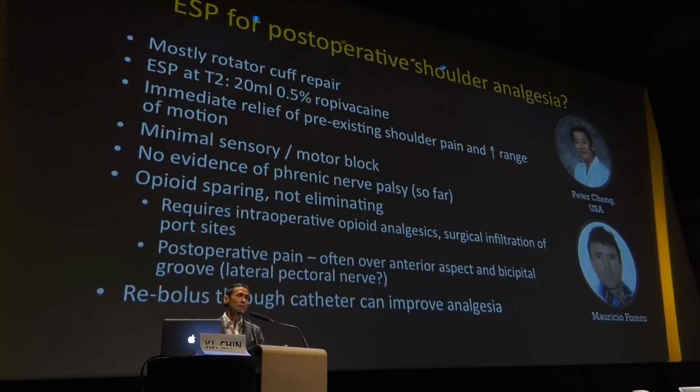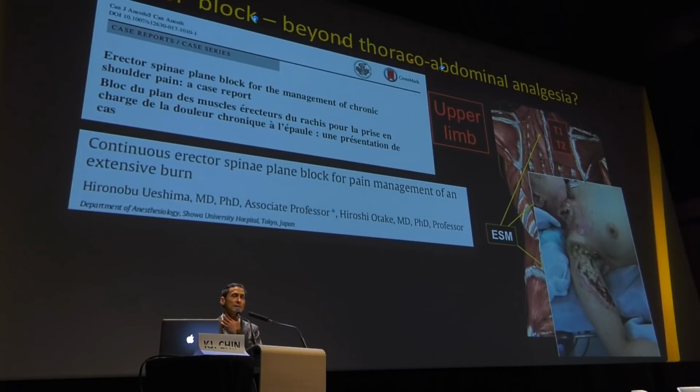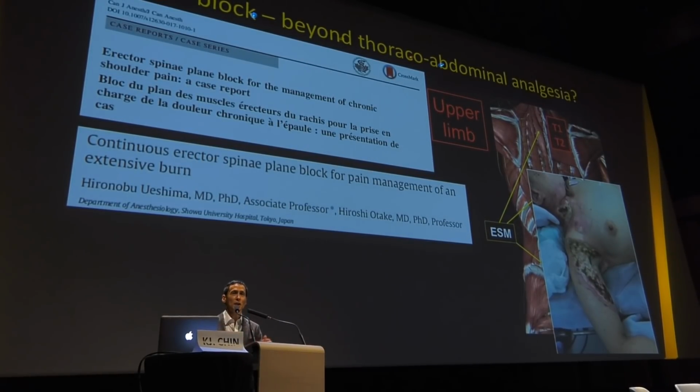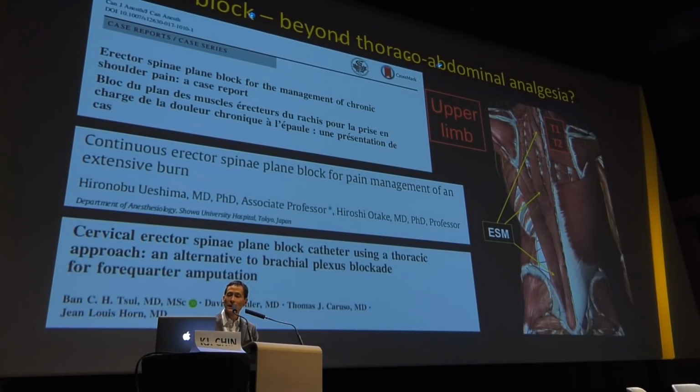But it's an interesting option to think about in patients in whom, for whatever reason, you cannot do a brachial plexus block. And this one report from the Japanese group shows you such a case, a lady who got an extensive burn. You can see that trying to put a catheter into the area of the brachial plexus would be almost impossible. They did an ESP block. The patient had pain relief down to zero. They kept the catheter in for 5 days and were able to use the catheter even for burn dressing changes and eventually too for anesthesia for a skin graft.